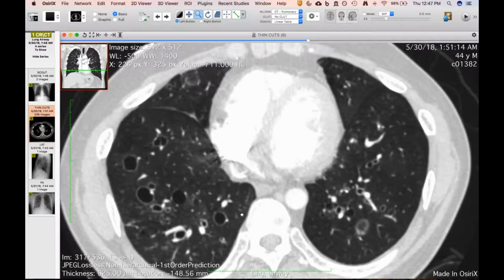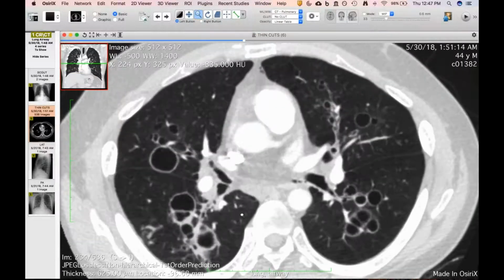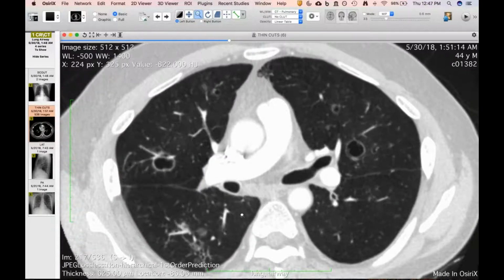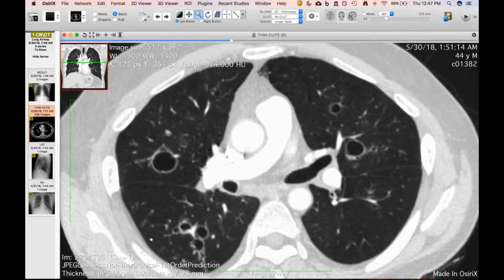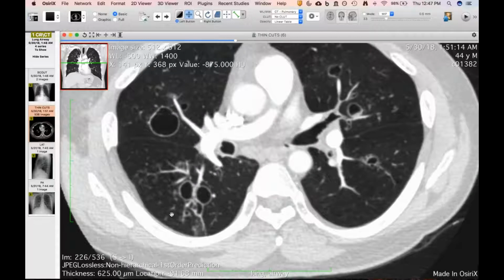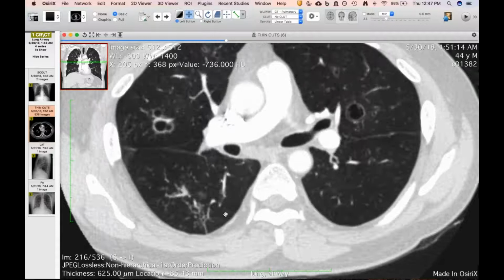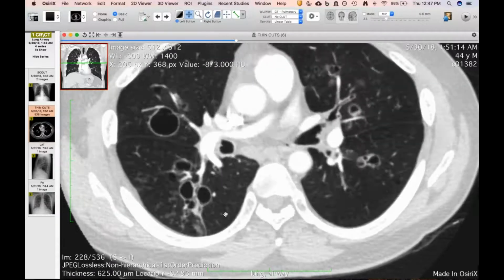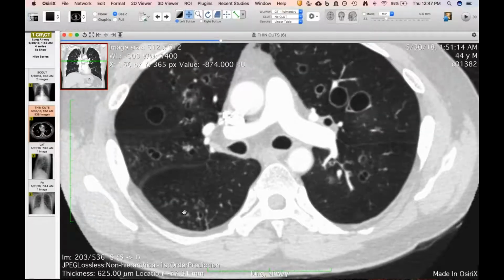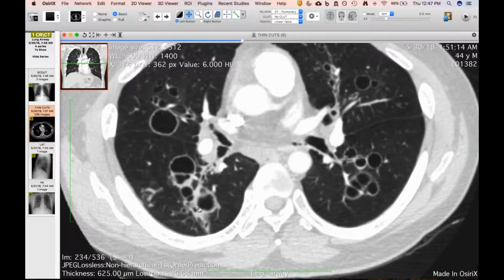I think I've seen in a bunch of places, maybe higher up, that the more distal generations of airways are not necessarily dilated, but are abnormal. And in a couple places, I think I see material in the lumens of bronchioles. So yeah, I think airways like out here are also involved. So I think it's a more extensive bronchial and bronchiolar process, which, I'm beginning to see tree-in-bud quite a bit, I think, in some areas, like there. That can just be obstruction from the more proximal disease.